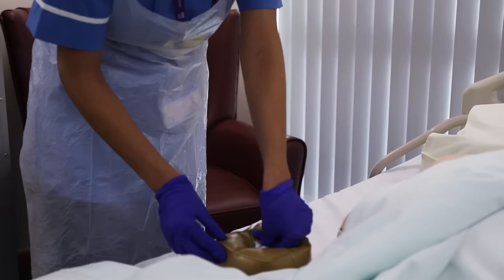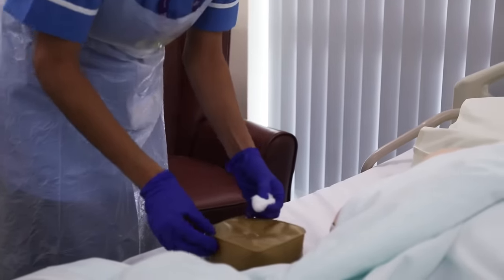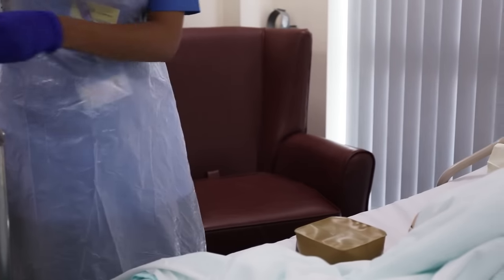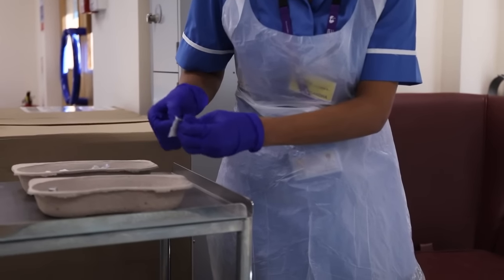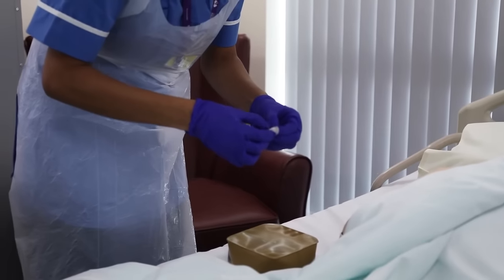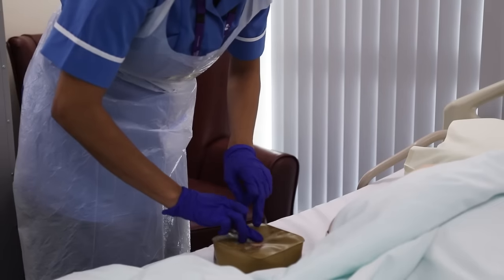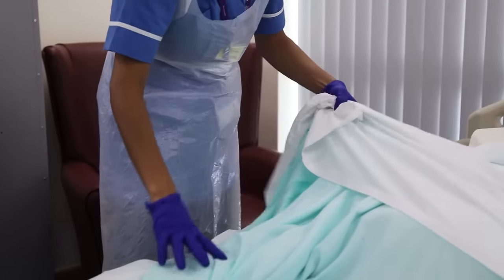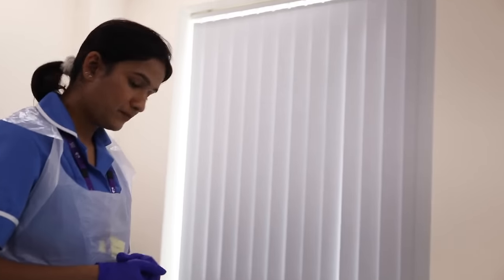Pressing the area. There's no sign of bleeding, John. Do you need a plaster? Yes, please. Are you comfortable? I'm comfortable. Thank you so much. Okay. It's nice to know that you're comfortable. I put the plaster, John. Okay, and covering you back. And if there is anything which you need, please let me know, okay? There's a call button, okay? Thank you.